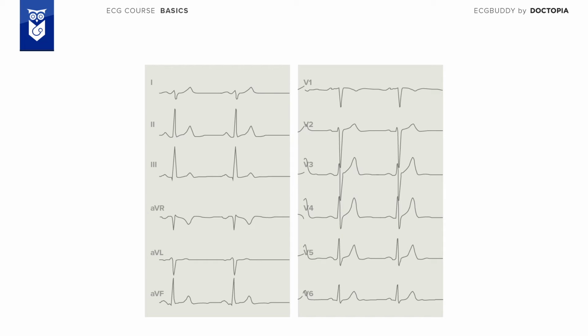What are the ECG leads called? There are three types of basic ECG leads. These were developed by the cardiologists Einthoven, Goldberger, and Wilson. The first type are called the Einthoven limb leads, and these three leads are denoted by the Roman numerals 1, 2, and 3.